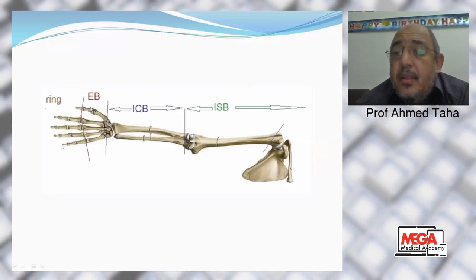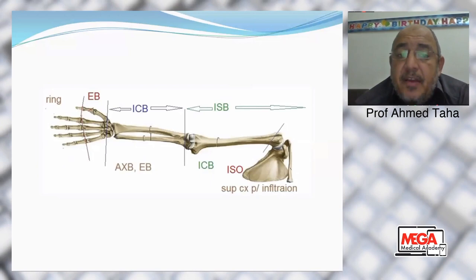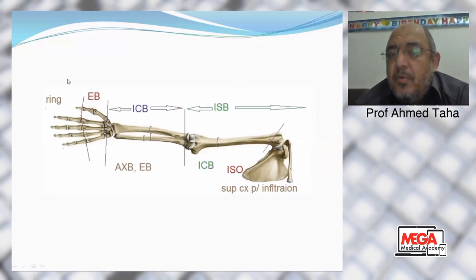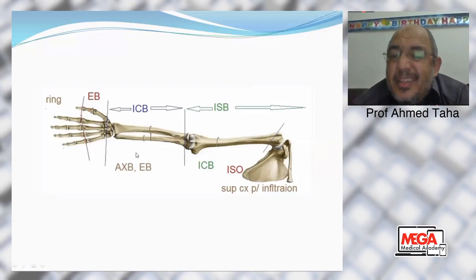If the surgery is in the finger, we can give the ring block. This is the first choice. I don't think there is any contraindication for the ring or elbow block. If the infraclavicular is risky, as in a patient with bleeding tendency, some people prefer to give the axillary, because infraclavicular is relatively deeper than the axillary, or the elbow block can still be used in forearm surgery.